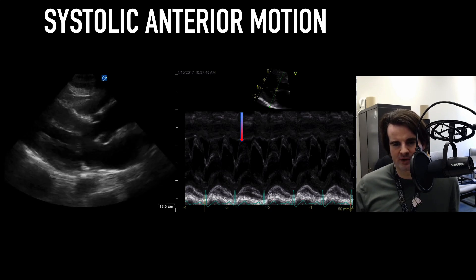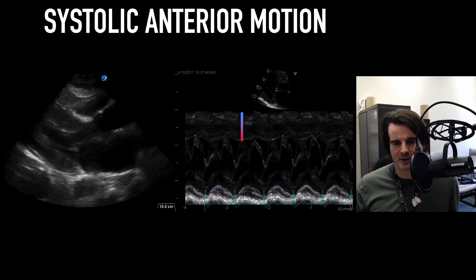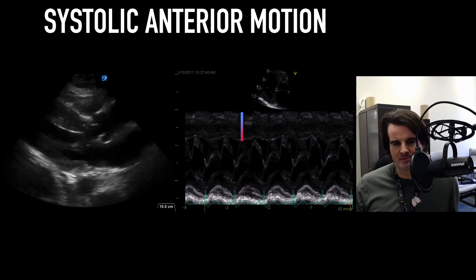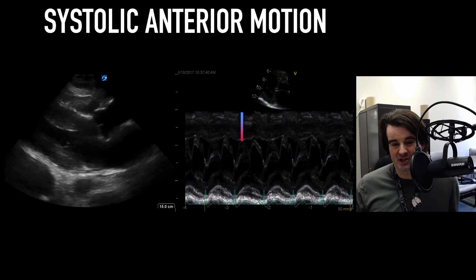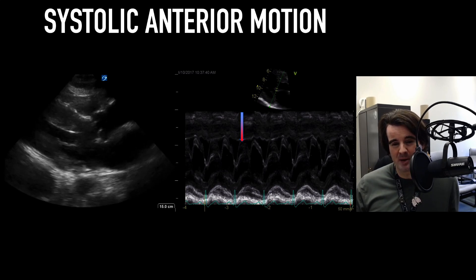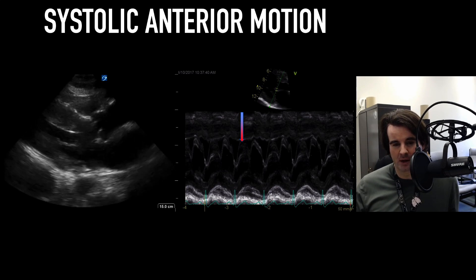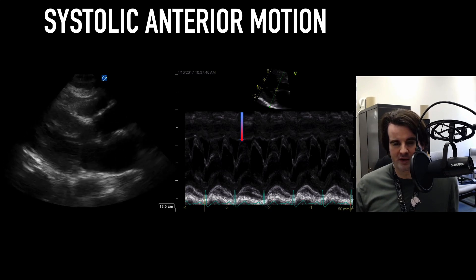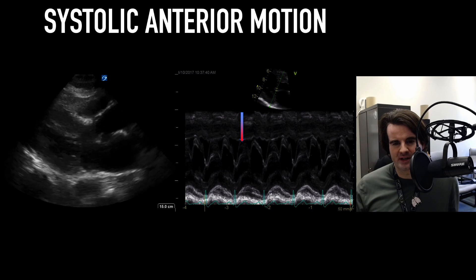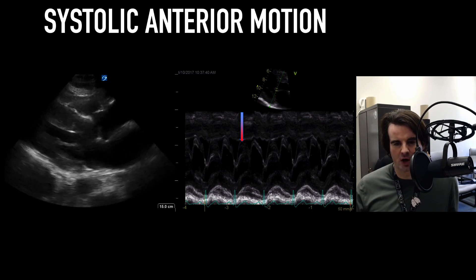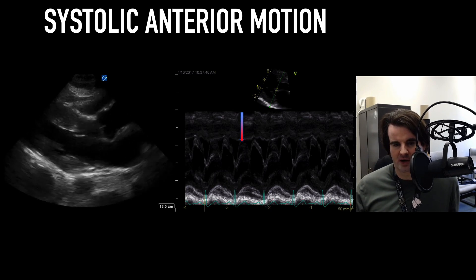This happens often — references cite the Venturi effect of being sucked in by high flow forces. But in fact, systolic anterior motion happens very early in systole, even when outflow tract velocities are relatively normal. So it's probably more than just the Venturi effect; it's more about the configuration of the ventricle and a drop in preload. There's also anterior motion of the chordae, called chordal SAM, which is usually less obstructive but still on the differential for systolic anterior motion.